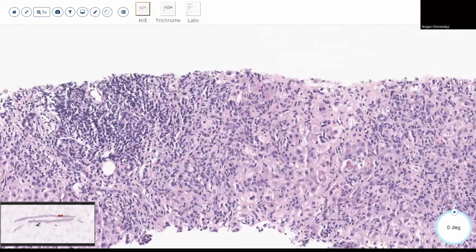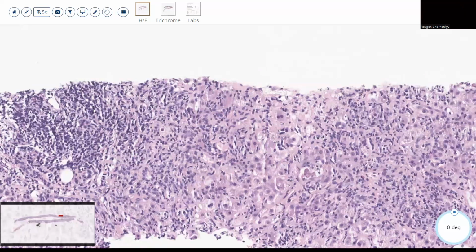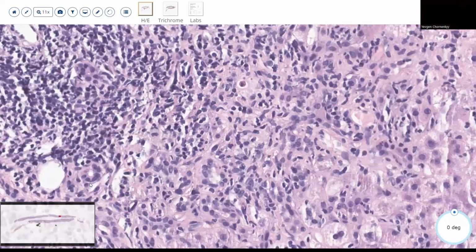There are lymphocytes and inflammation, and there's plasma cells in here too, I'll prove it to you. We'll zoom in. When they're spilling out from the portal tract into the parenchyma, what do you guys call that? Interface, yeah. And when you're saying interface hepatitis, what things are you thinking about? Yeah, autoimmune should definitely be up there. You see this bile duct, it's like a donut, but half of it's been eaten. So that's bile duct damage.